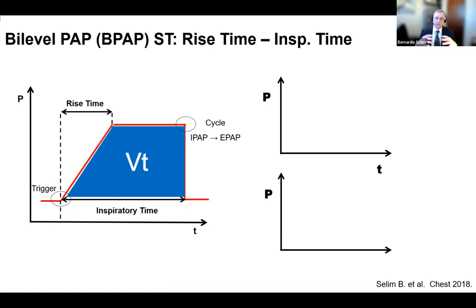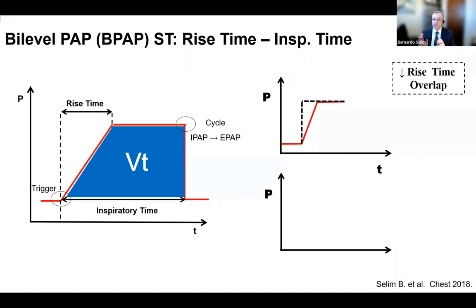So let's go step by step in these components, because again, this is a concept that you need to understand if you decide to intervene in these settings. So let's go a little bit about the rise time. Let's say that this is the normal rise time, and you decided to do the pressurization in a much shorter period of time. Look at me, what I'm going to do. So I'm breathing, and all of a sudden, when I start my breath, if I shorten it, this is going to look like that. If I do it slowly, it will look like that. So the pressurization time is the amount of time that it will take to change from EPAP to the IPAP.